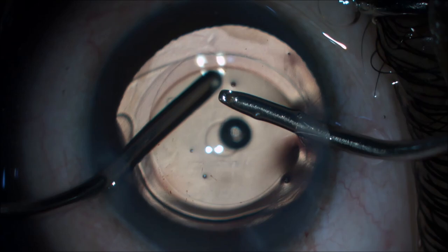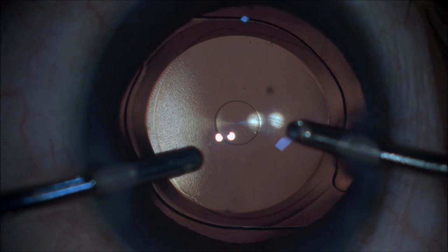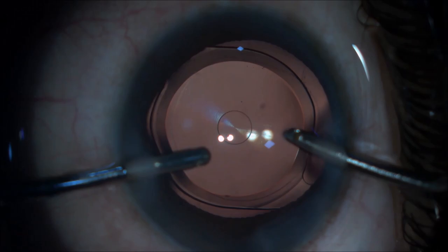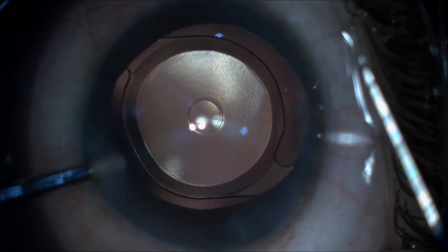After the IOL is implanted, it is dialed into position with good centration. After IOL implantation, the anterior chamber is washed thoroughly. The anterior chamber is formed and ports are hydrated.